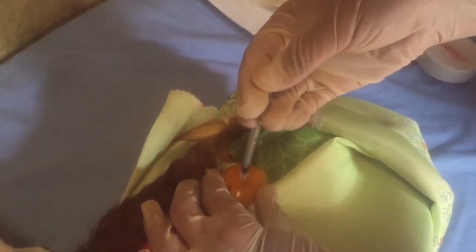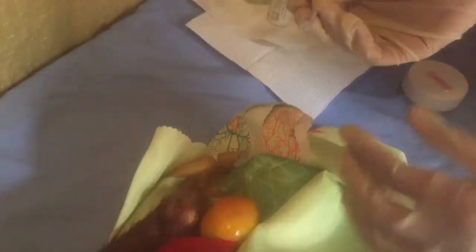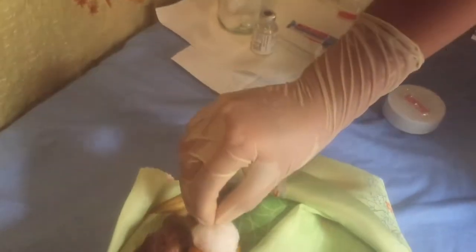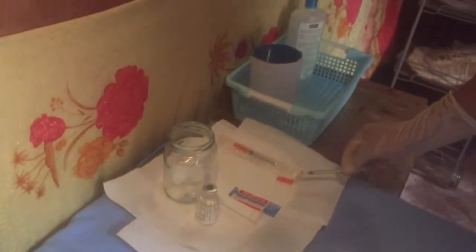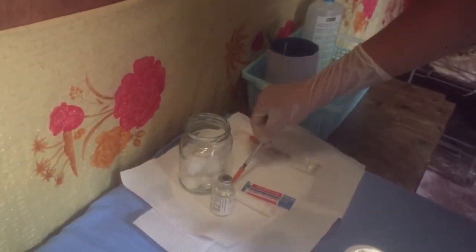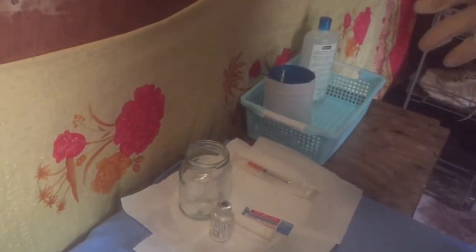Remove the needle at the same angle and make sure to discard it directly, and put a cotton and band-aid on the injection site. Covering it would prevent infection at the injection site. Make sure to put the cap on the needle and discard it properly to ensure that there is no needle stick injury.